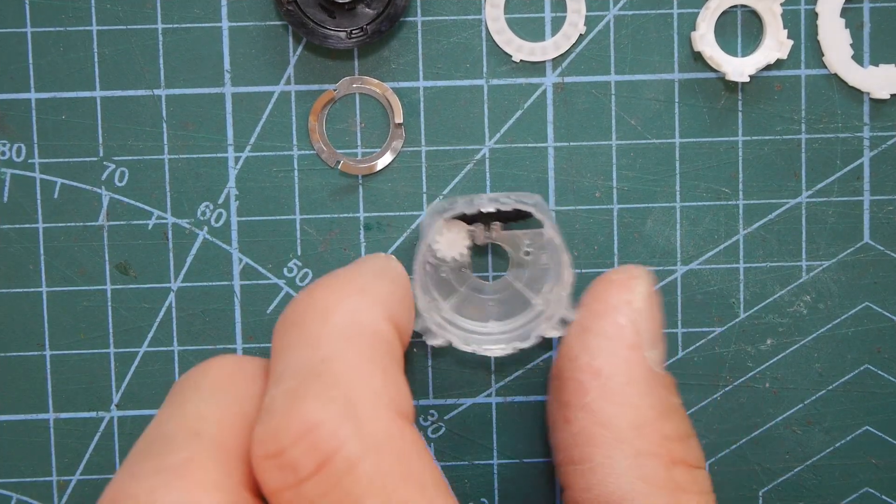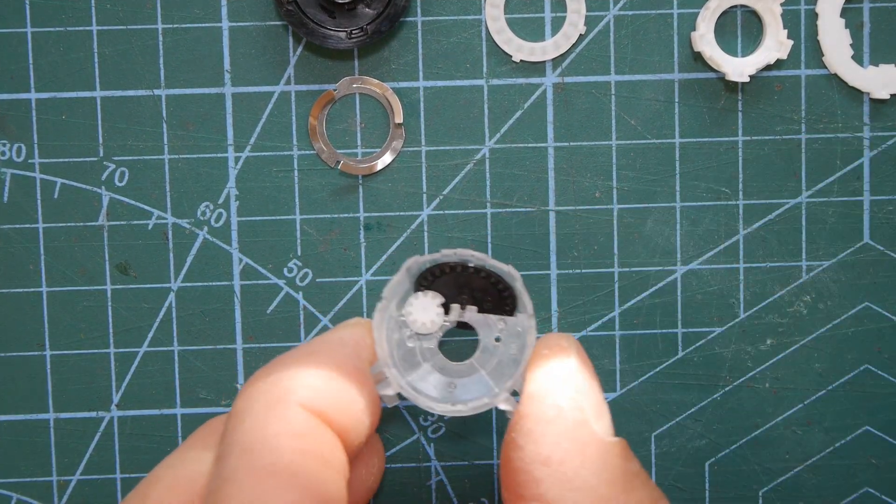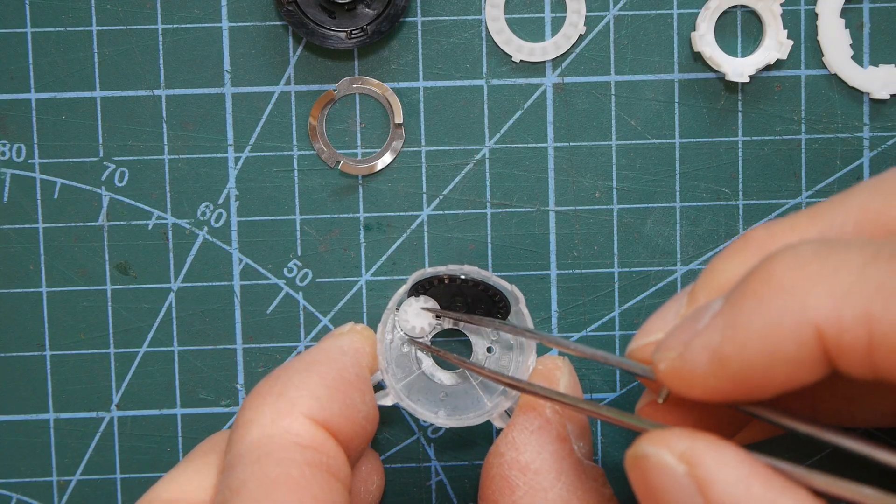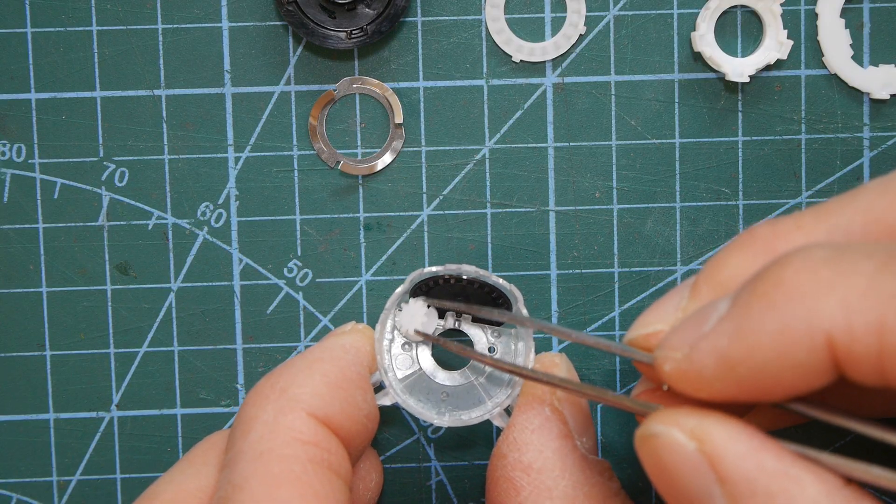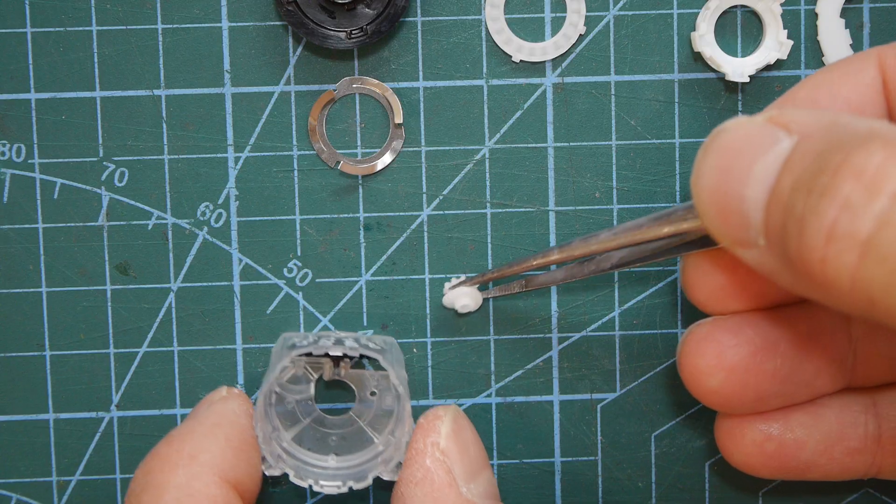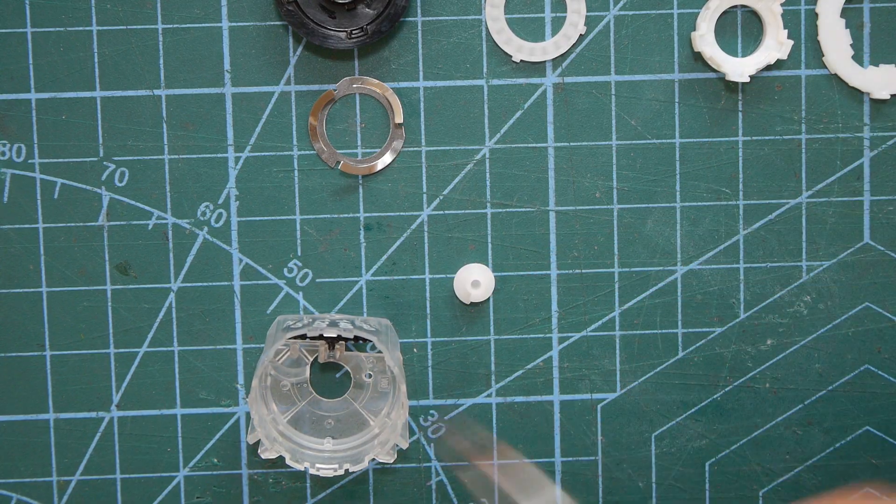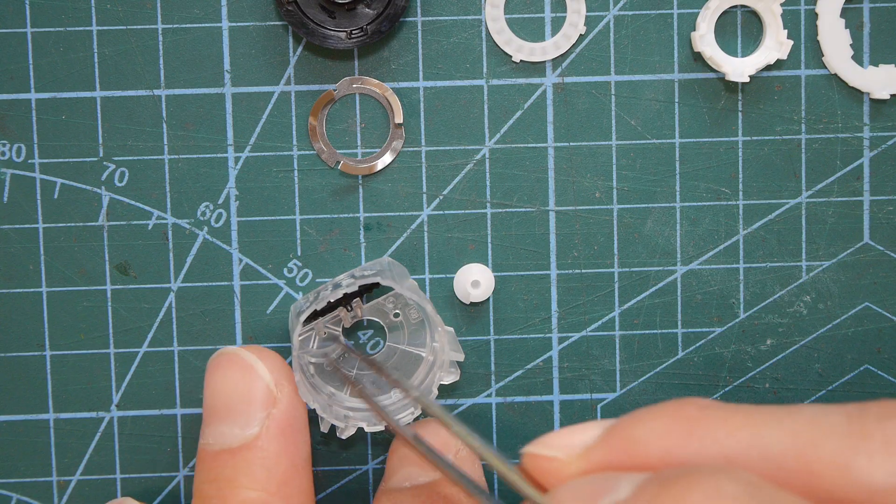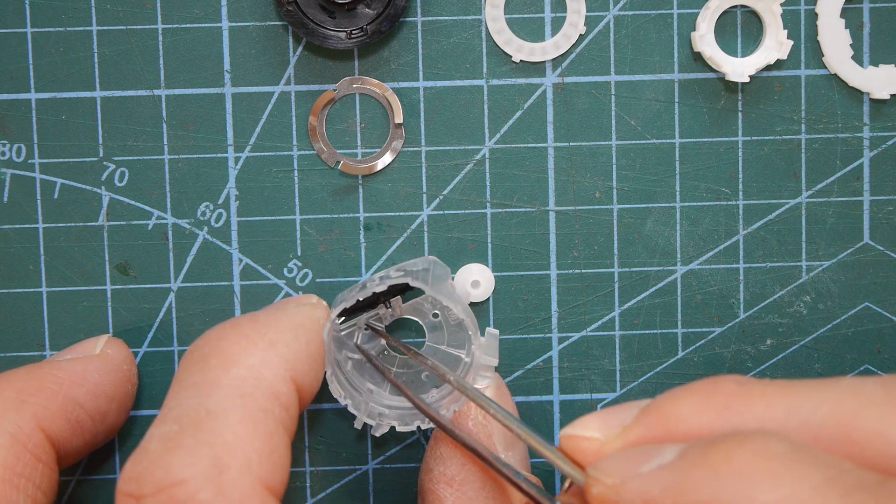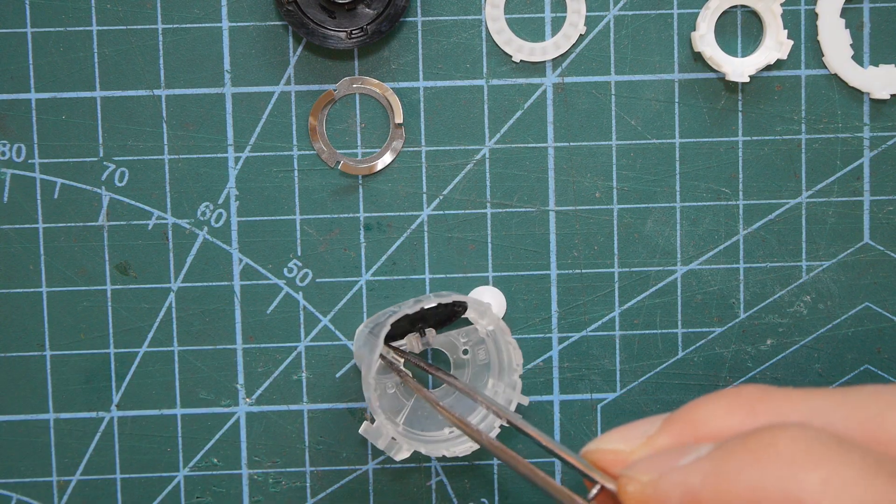So now let's take the gears out from inside here. Here's a little white gear that's directly connected to a worm drive and that worm drive drives the black counter wheel around and it sits on its own shaft there.